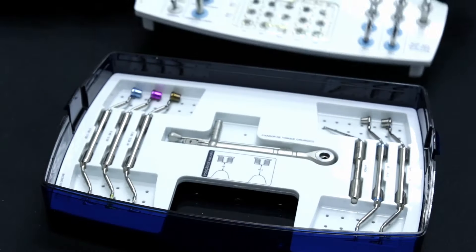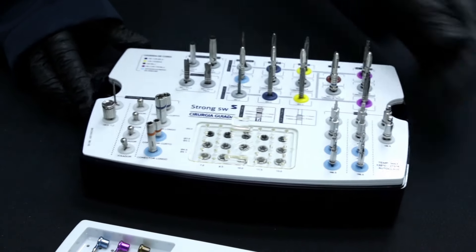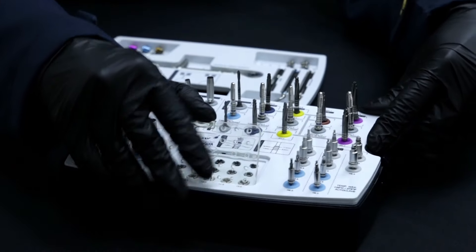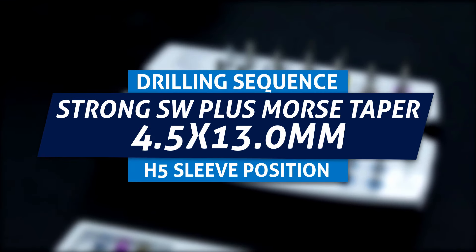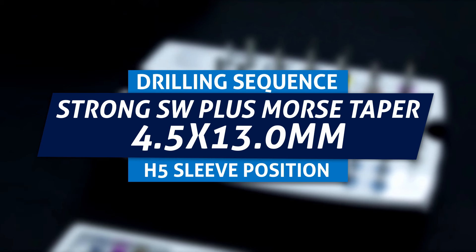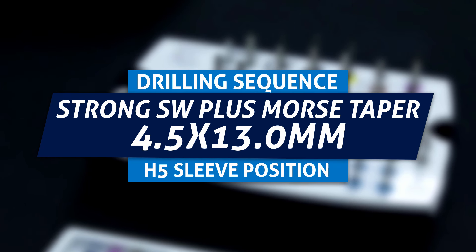The kit has two levels with a removable tray and bottom. There is also a protective cover for the stoppers at the Safe Drill Kit. The implant used will be the StrongSW Plus Morse Taper 4.5 per 13 in the H5 sleeve position. In this case, the distance from the guide sleeve platform to the implant platform is 9mm.